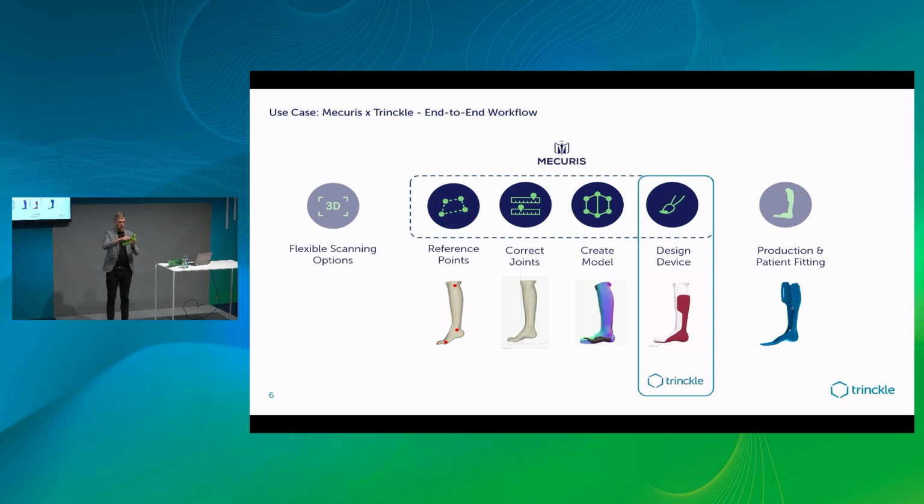So the orthopedician can create those trim lines, cut out whatever material is not needed and not wanted, and then end up with, let's say, the outline of the design. So basically, the orthopedician has really the chance to design a completely new product that for this individual patient is needed.